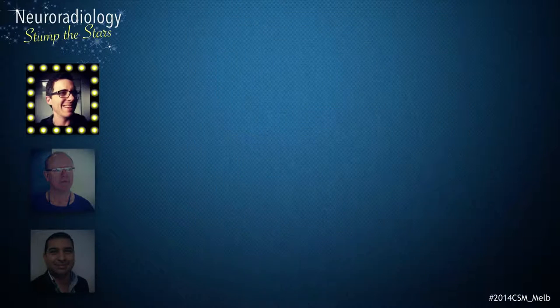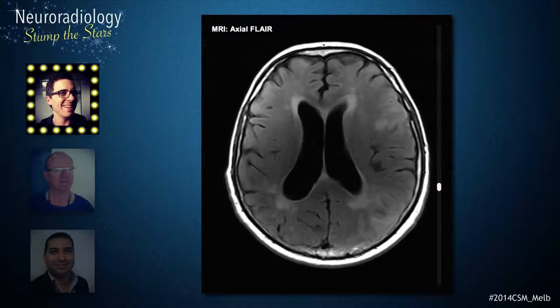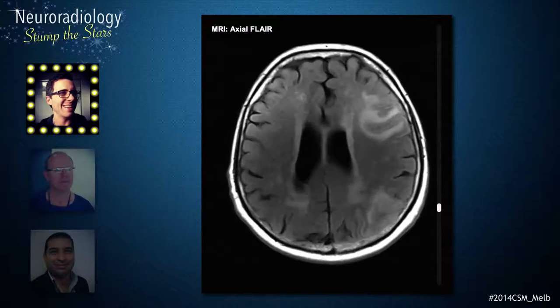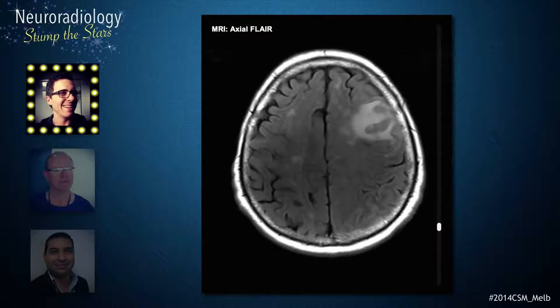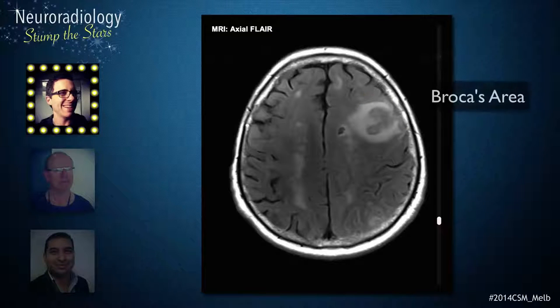On FLAIR, there is widespread high T2 signal with a relatively circumscribed region with some positive mass effect involving the left frontal lobe. This involves Broca's area, accounting for the patient's expressive dysphasia.